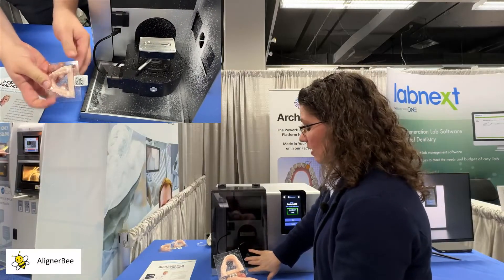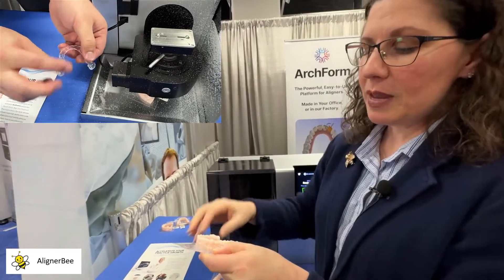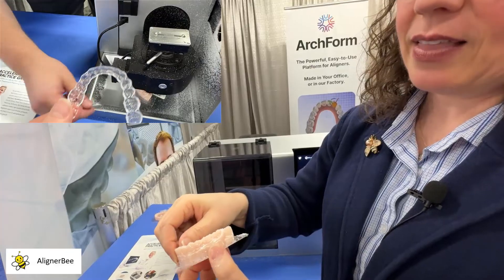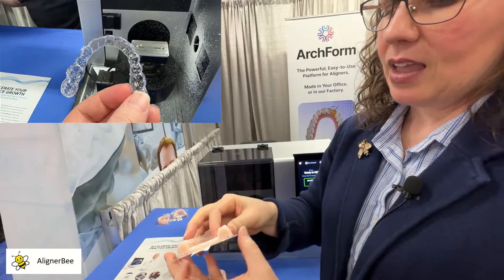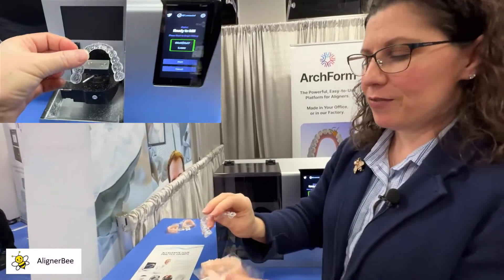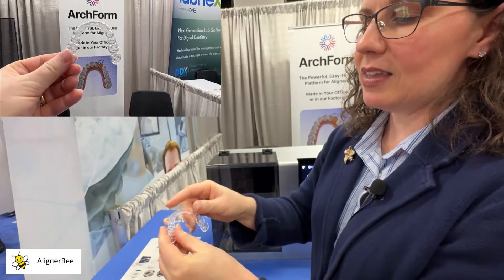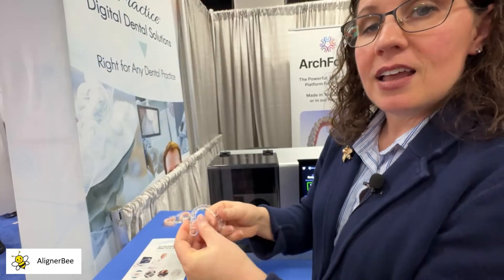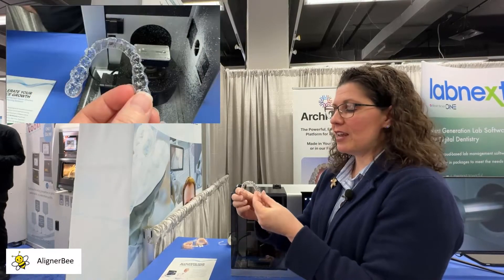You could always utilize a vacuum in your office to remove the dust. And we can see here that there has been a custom trim line cut that's scalloped to create the edge and the trim line of the clear aligner. I'm simply going to loosen the aligner on one side of the model and peel it off. As we can see, there is a very smooth trim line that has been created. Some may choose to use this as is; others may choose to use a polishing wheel and give it a quick polish. But it's a very, very smooth trim line and finish for the clear aligner.